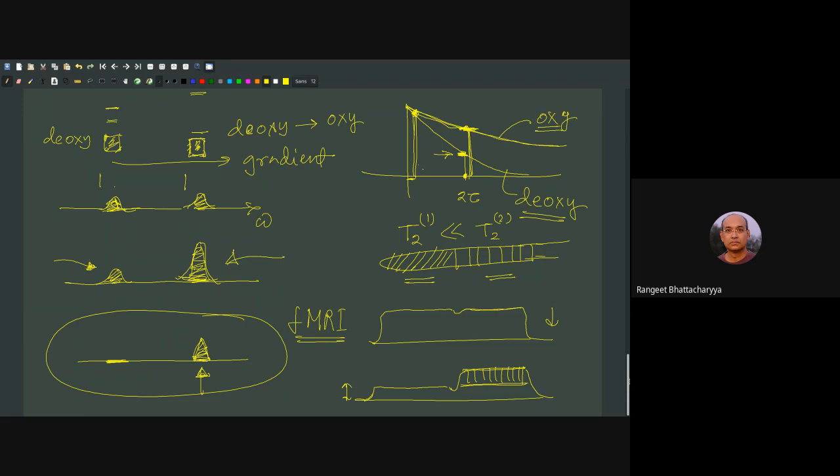And then while the person is focusing on that, or processing that information, reading something, you record the MRI once more. So you record two MRIs, one with a very short delay, the other with a longer delay. The longer delay ensures that you have your T2 weighted images, and then you take the difference of the images. The difference will tell you where the activity is going on. That is how you identify the active region using functional MRI.